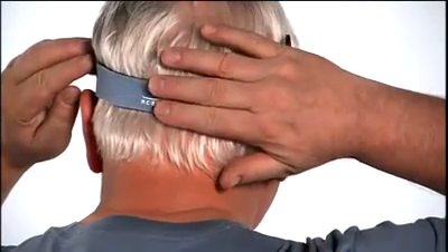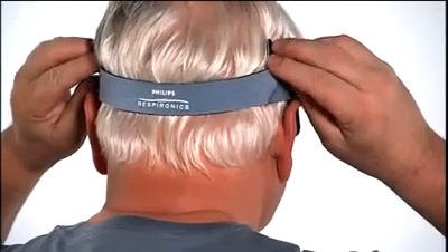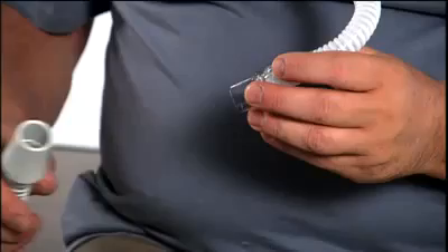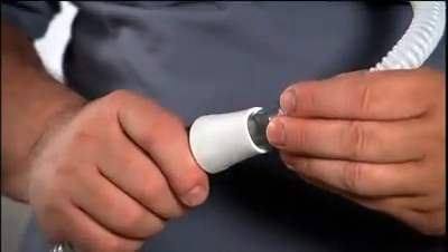The back strap should be positioned at the base of your head. Do not over-tighten the headgear. Make final adjustments while lying down. Connect the mask to the device tubing.